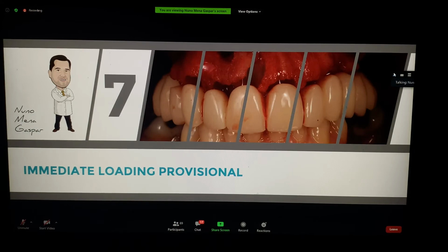First of all, you should have a CT scan, and if you have a CT scan, you can do digital planning with R2Gate or any other software there is to plan it. So the guide helps us to mark on the ridge, 7 and 7 millimeters, and between each mark, each line, you know that we'll have 30 degrees deviation.